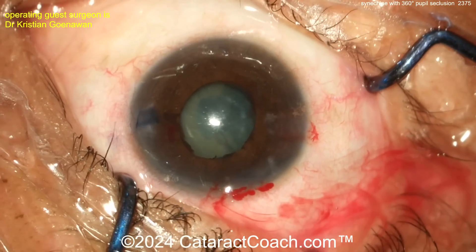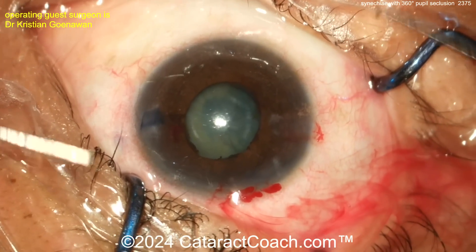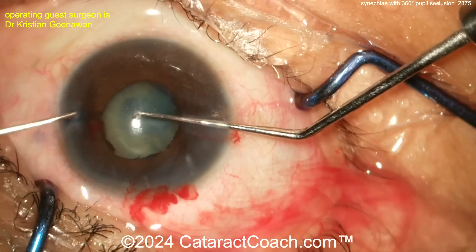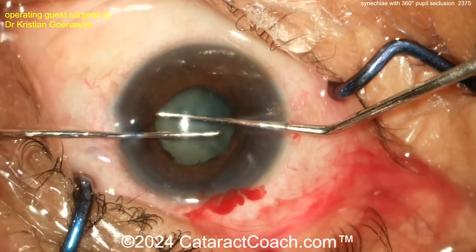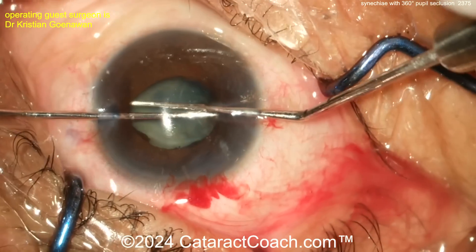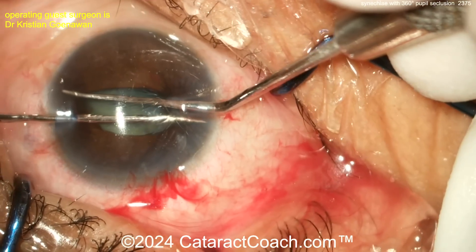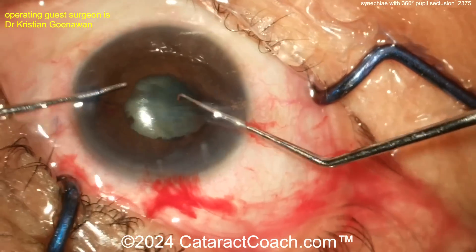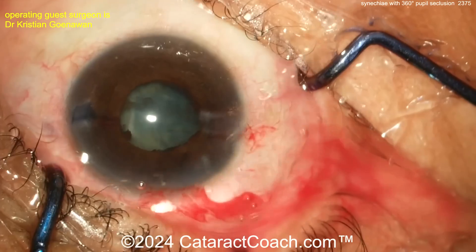More stretching happening here. At this point you may also have been able to put in a pupil expansion ring, or — probably my preference — iris hooks in a case like this. You get much better exposure that way and less stress. But let's see what we get here.